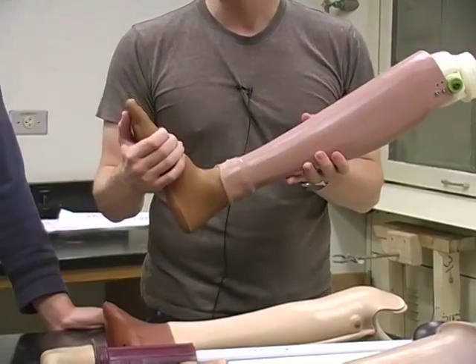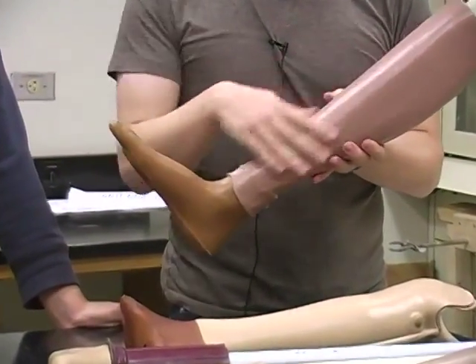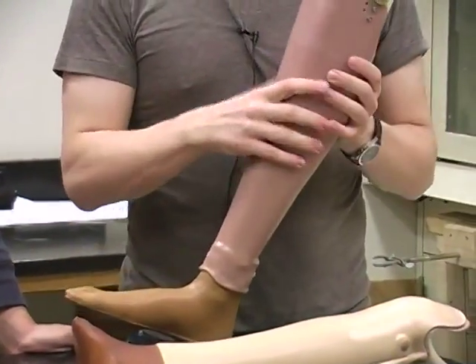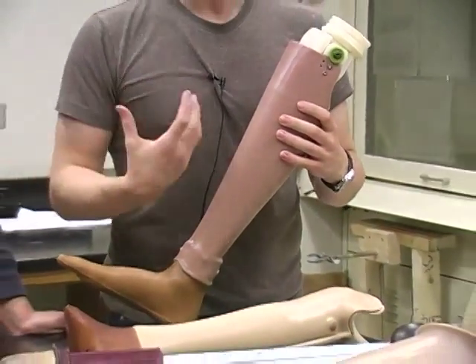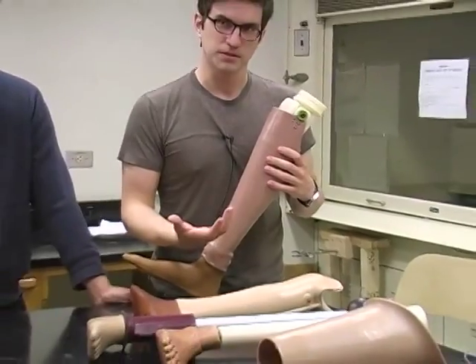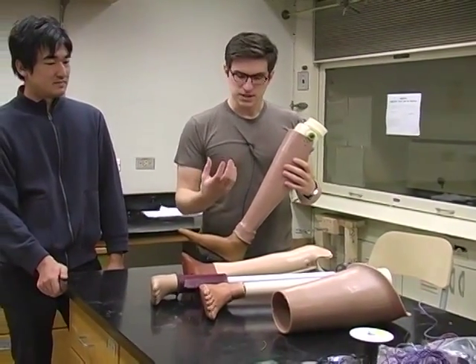This is a handmade foot — all handmade. It's a very simple manufacturing process that involves a lot of local people and employs a lot of people, by this organization.